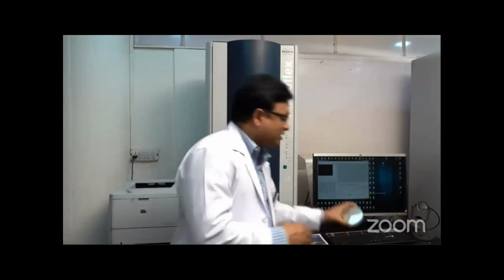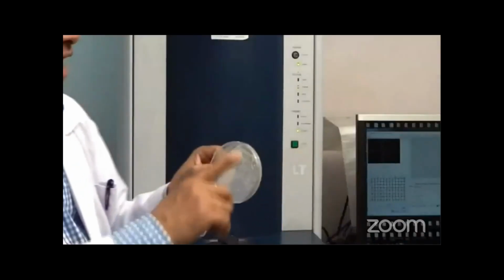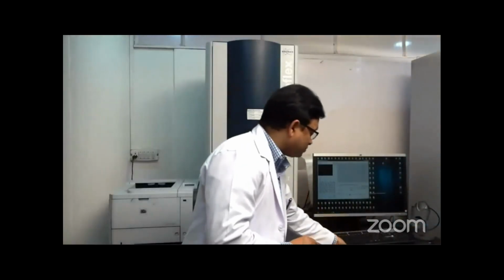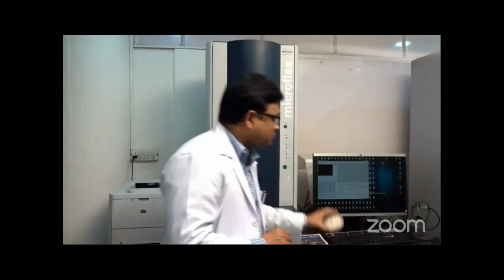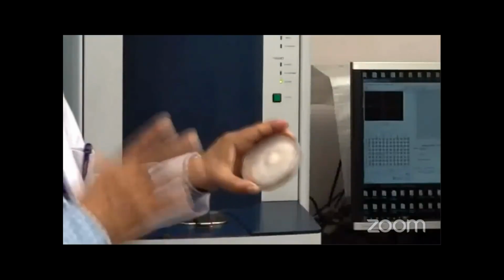So if I show this plate, this is a pure yeast growth, and you see this is the isolated single colony, and this is the fresh growth process, these species for the identification. This plate is mold, and this is a Fusarium growth, and this is also young growth.